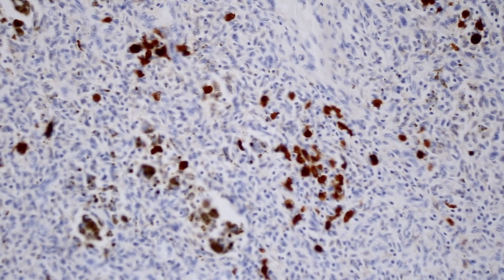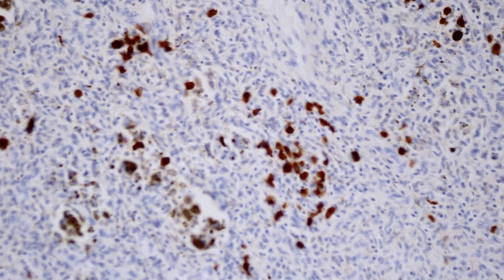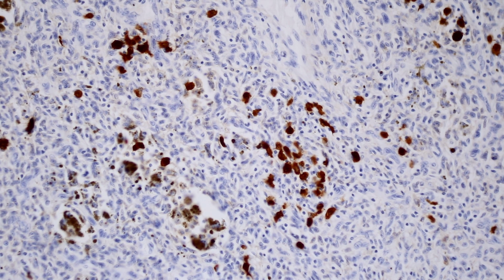The first point is that with S100 positivity, you will often see clustered, kind of positive aggregates of positive cells. These are probably either Langerhans cells or other forms of S100 positive dendritic cells. Usually we see scattered dendritic cells in the dermis on S100 stain. We often see them in a variety of tumors, particularly in skin tumors that are inflamed. The more inflamed something is, the more abundant these S100 positive dendritic cells will be.